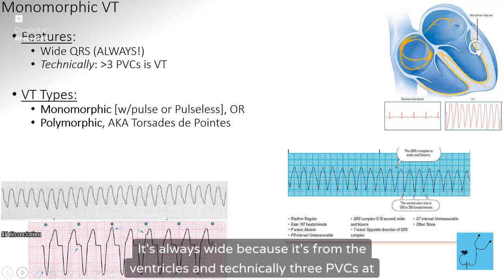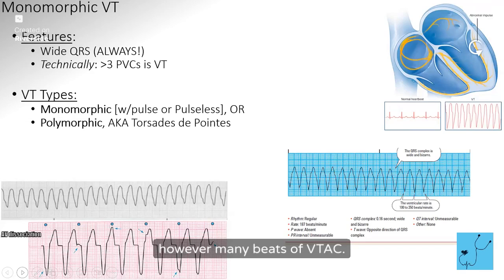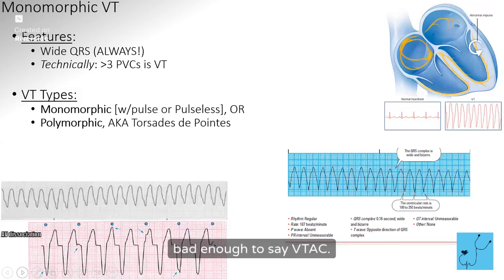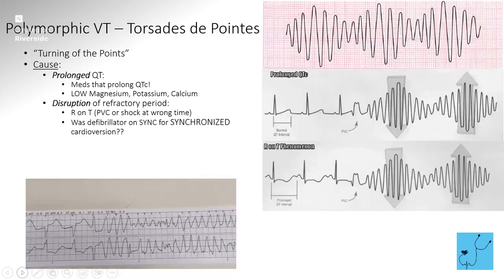It's always wide because it's from the ventricles. And technically 3 PVCs is VTAC, but we're probably not going to call the doc until we have like 10 beats. But you're going to let the nurse know, hey, you've had 3 beats, 5 beats, 10 beats, however many beats of VTAC. You don't necessarily have to say mono or polymorphic unless it's clear, but VTAC is bad enough to say VTAC, okay? So it pretty much just looks like this. The only variation is if the patient's moving somehow.